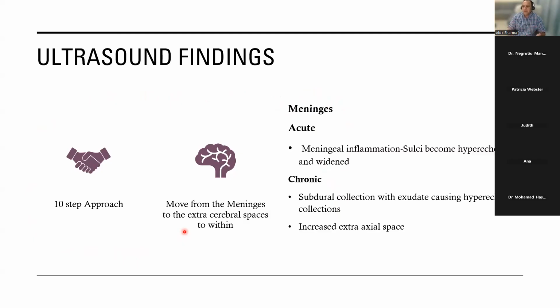In that we know that meningitis, or an infection that presents with neurological manifestations of the brain being affected as part of that infection, starts because of hematogenous seeding of the meninges through blood vessels. And that really produces inflammation. Now, this meningeal inflammation basically presents with highlighting of the sulci. So they become edematous. They tend to accumulate inflammation. The blood vessels and vascular supply to the meninges increases. The content of water in that area because of edema increases.